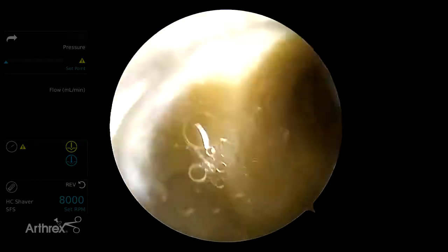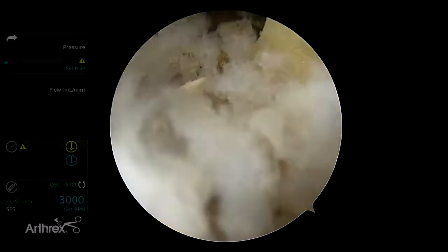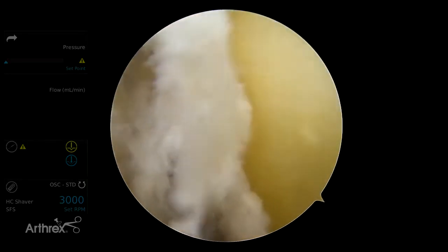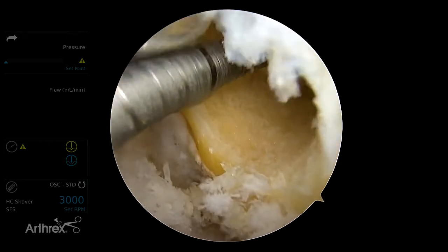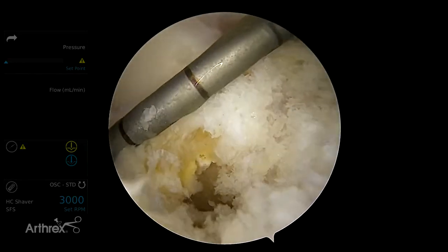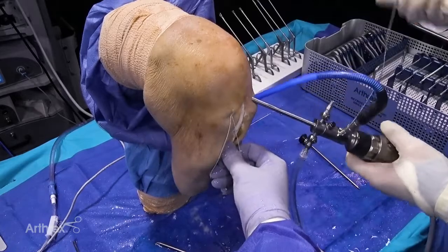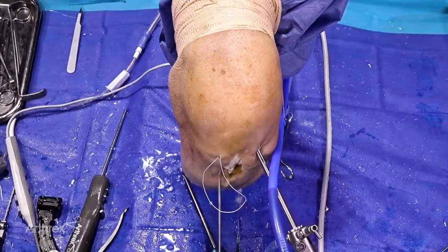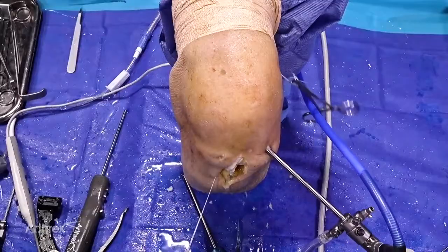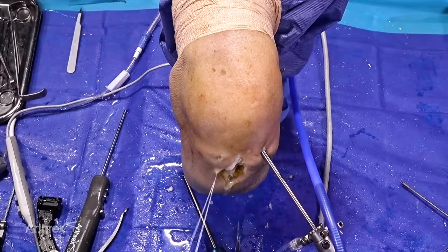We come out on high speed which cleans the reamings from the femoral tunnel. A suction device can go up the tunnel to clean debris, and a Yankauer tip can be fed over the wire — another benefit of the system allowing us to go straight up the tunnel. We can see our nice two millimeter back wall, and the oblong hole comes out nicely anteriorly producing an appropriate anatomic trajectory of the ACL. The wire now functions as a passing wire to pass our passing stitch out the lateral thigh and through the femoral tunnel. The tibial tunnel is already prepared, suture retriever is taken up the tibial tunnel, and all tunnels are drilled and ready for graft passage.